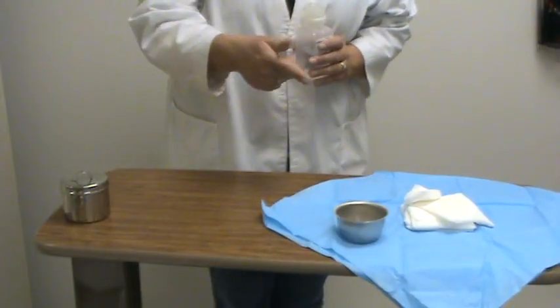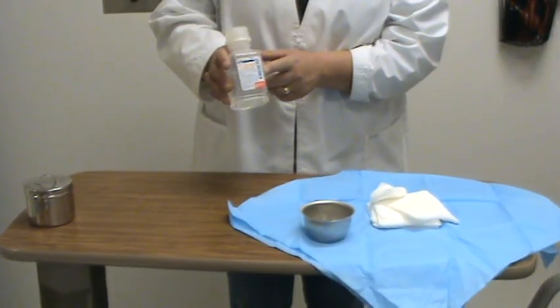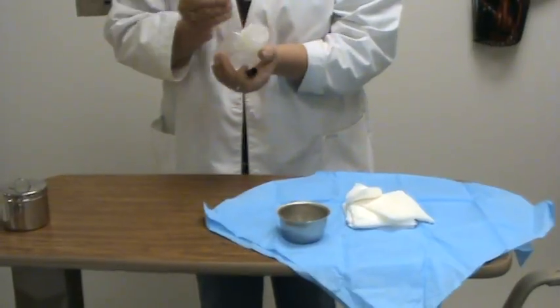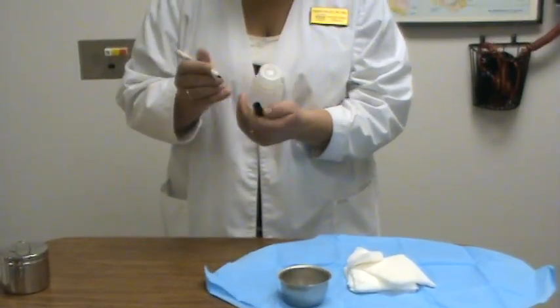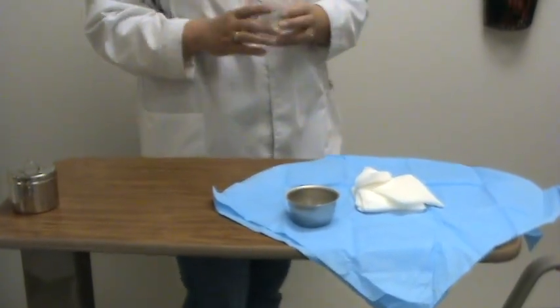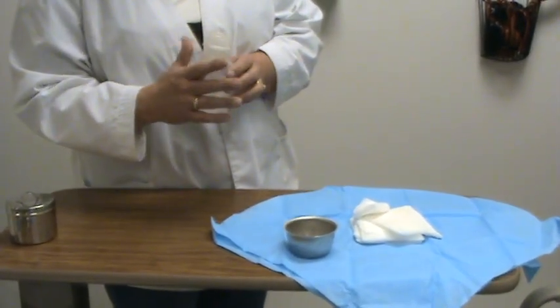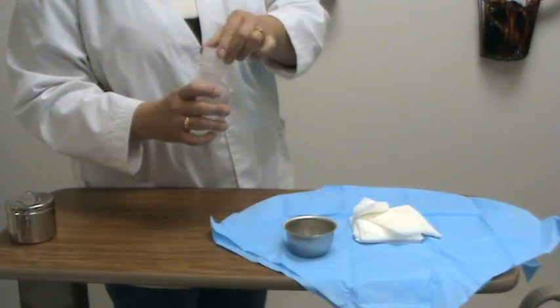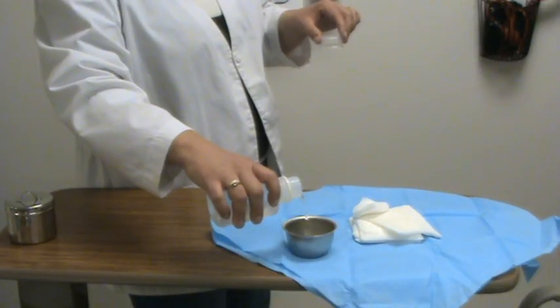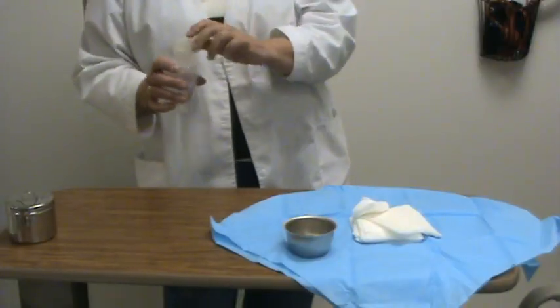I want to add water to this because I know he needs it. The solution ordered is normal saline — we'll say this is a new bottle with the cover already off. I need to date the bottle because it's only good for 24 hours. Don't work over your sterile field. When pouring the liquid, put your palm on the label to keep it dry, keep the cover down, come in from the side. You don't want to be too close or too far because you'll splash.